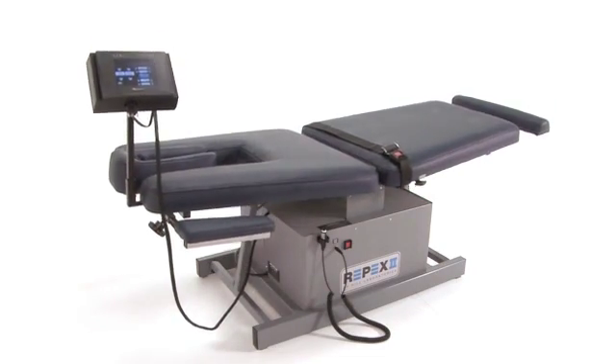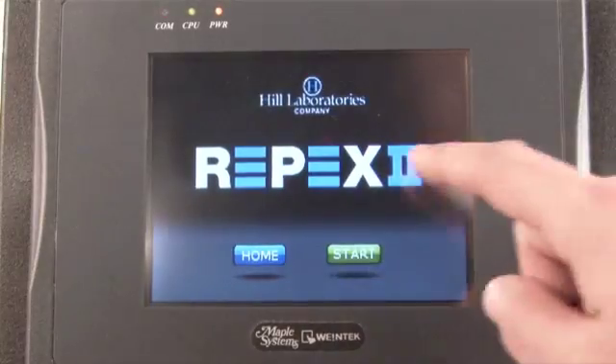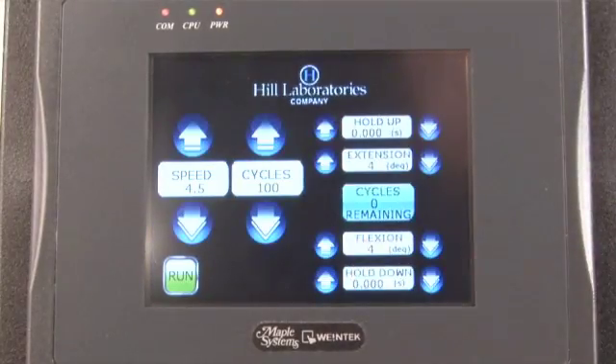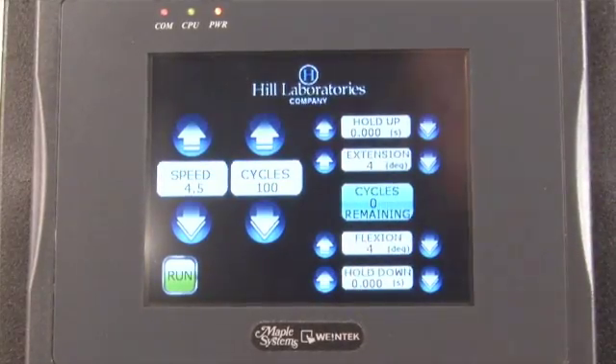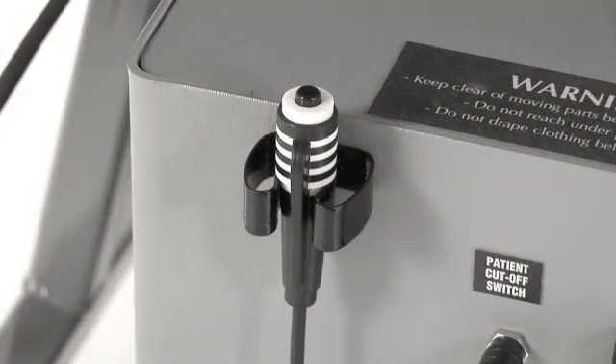To turn on the table, press the power button located in the center of the table base. Then press the start button to load the default parameters and begin using the table. The table comes complete with a slide-out ankle support for taller patients and an emergency cut-off switch.